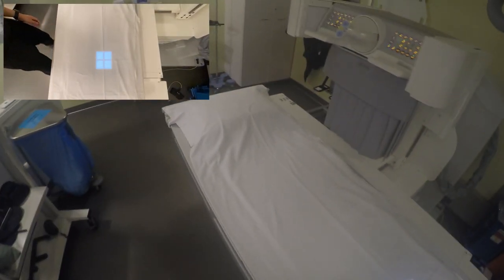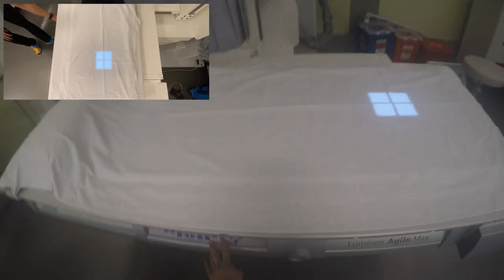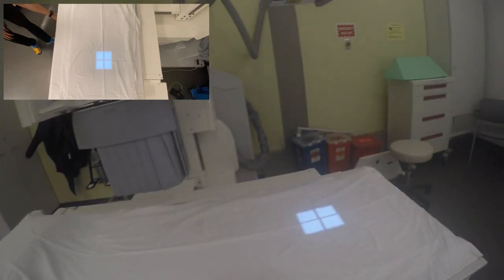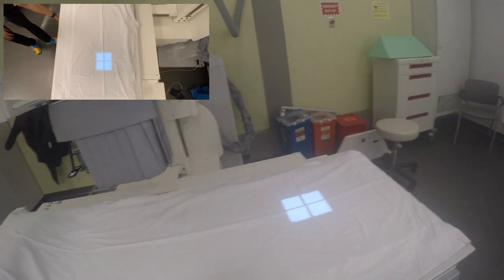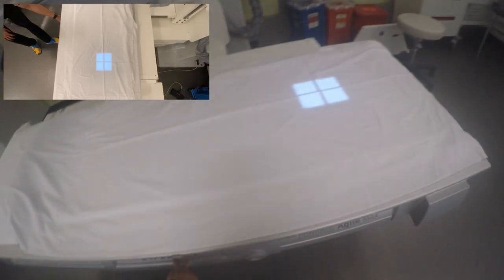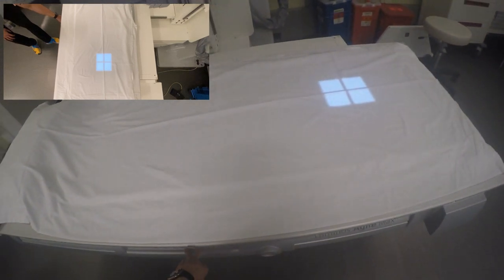I already had my table ready with a sheet and pillow — now all I have to do is put the image receptor in the bucky and detent the tube to the table. Being a long exam, you'll find yourself with some awkward quiet time. I don't recommend this for beginners, but as you become more confident, I suggest talking to your patient and multitasking. Do not stop everything to stare and talk to them. I do endorse talking though, as it makes your patient more comfortable and builds rapport — but proceed with caution, as you can get a myriad of interesting stories.